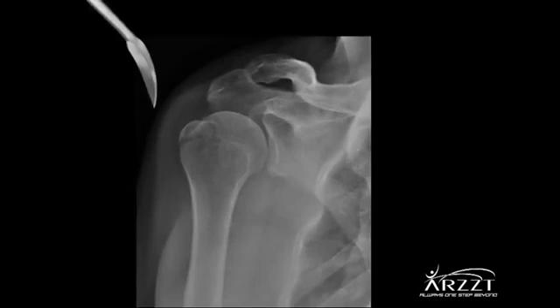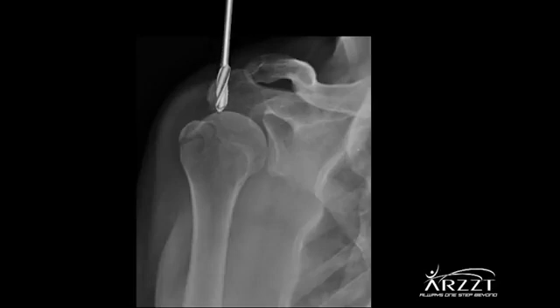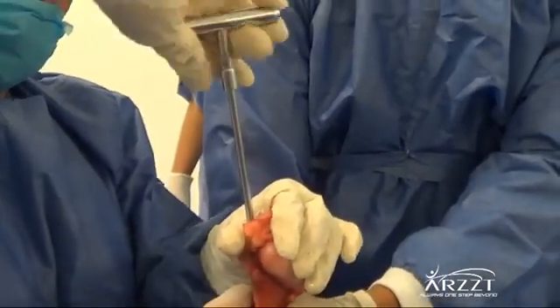The starting bradawl will be introduced following its curvature, which will be calibrated when entering the medullary channel. Then, the 7 and 8 mm reamer will be used to enlarge the channel diameter.